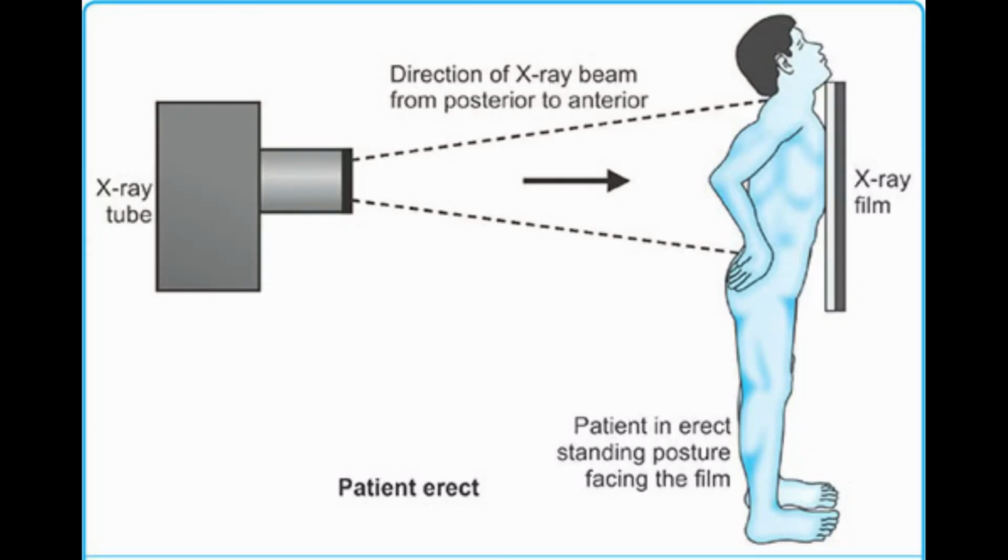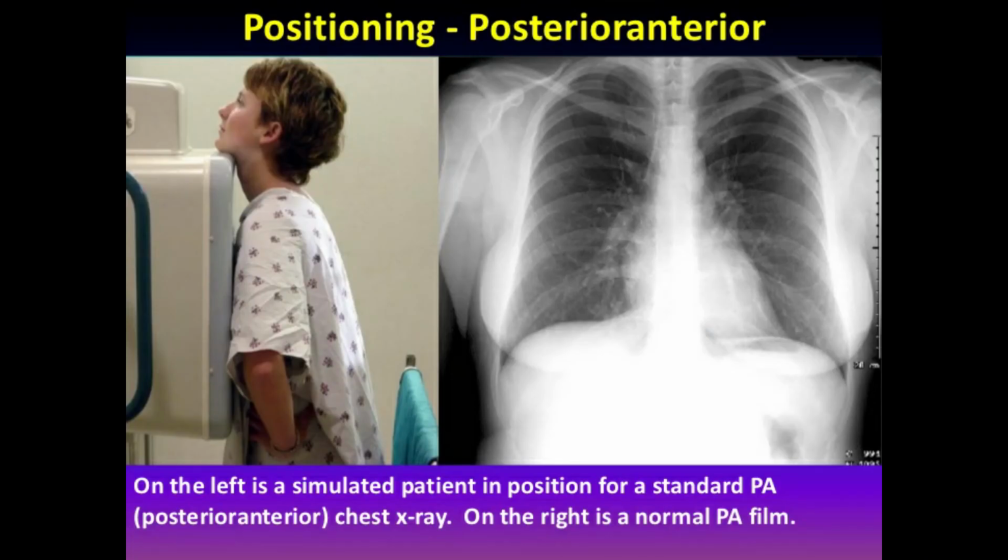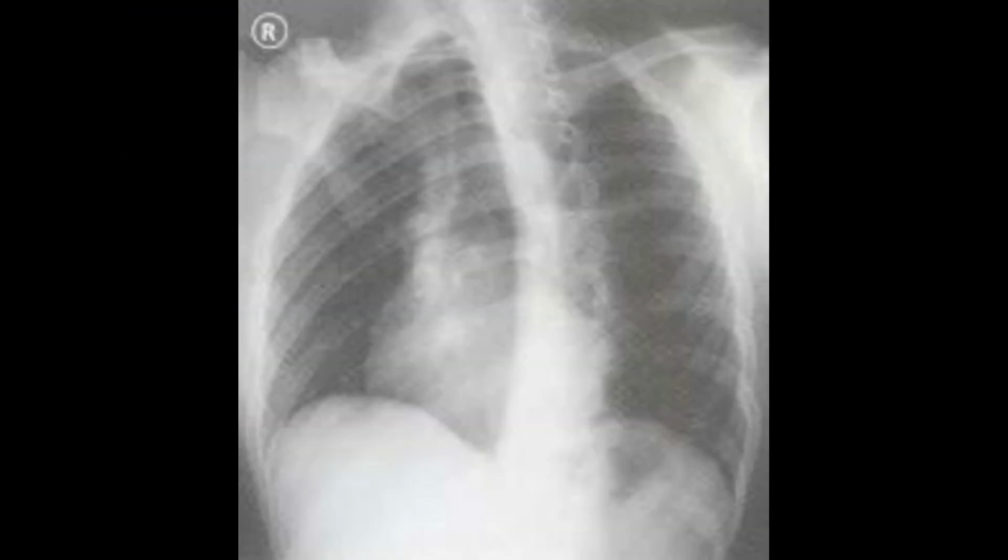During the exposure, you must hold very still and may be asked to take deep inspiration and hold for a few seconds to reduce the possibility of a blurred image. If you do not hold the breath during the chest x-ray, then the pathologies we can't determine.